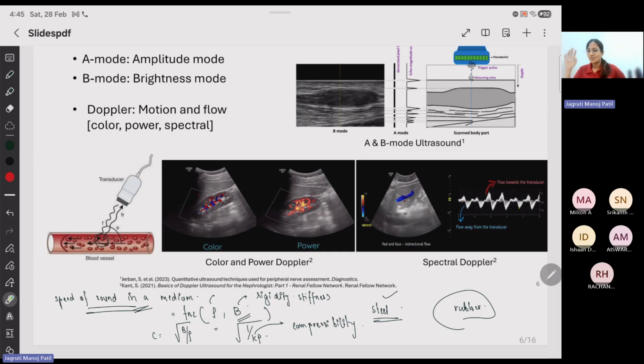This is opposite to how it's done in astronomy. So there's an opposite convention, and this convention was taken solely because it is easier for clinicians to follow. Okay, then you have power Doppler.